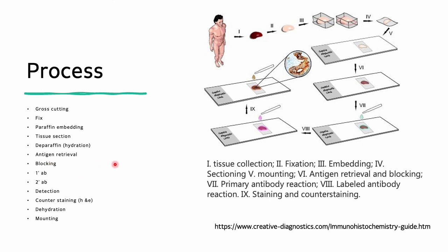After paraffin embedding, we section them, we deparaffinize them because paraffin interferes with the staining process. We go over the antigen retrieval step, and like Western blot, we go over the blocking step, and then we attach the primary antibody and the secondary antibody, which detects the end of the primary antibody, and we go over the detection step. This is done on the slide you can see here.